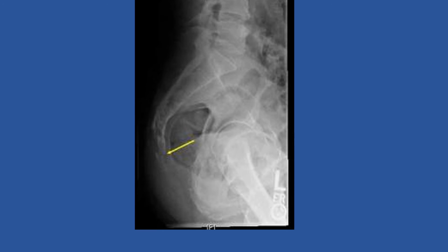The only way to really be sure if somebody has an acute coccyx fracture is to do a rectal exam and elicit crepitus by touching the coccyx. Rarely is that necessary, because rarely will it change your treatment. You're just going to use pain medicine and try to keep them comfortable until it heals up on its own.